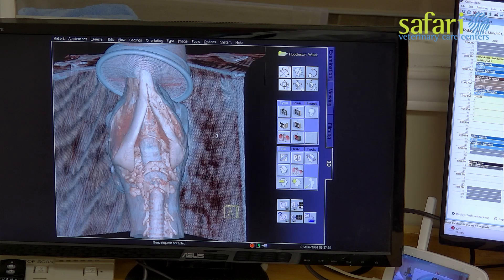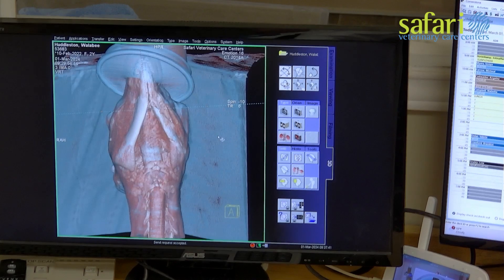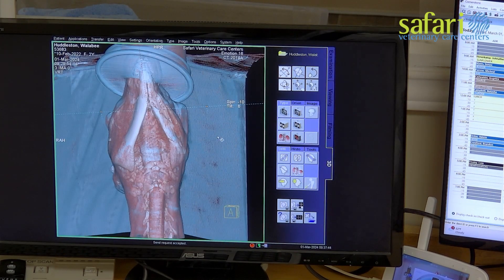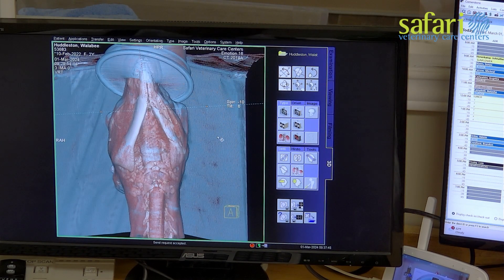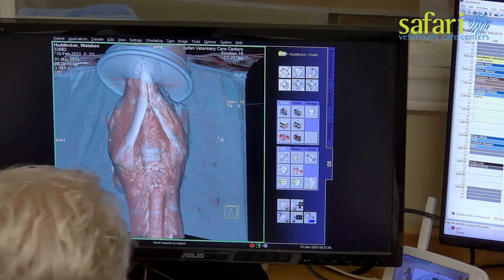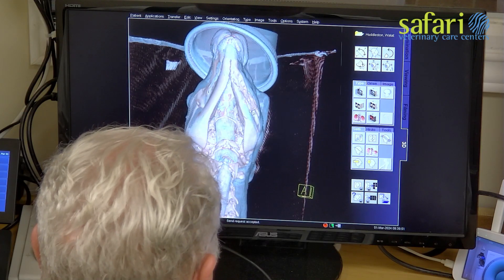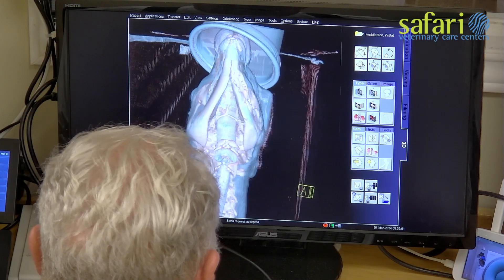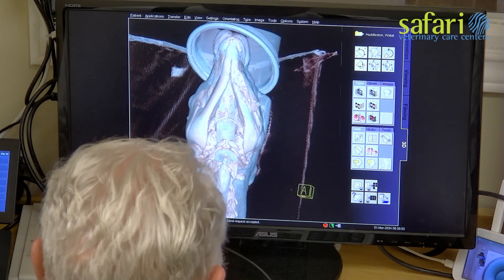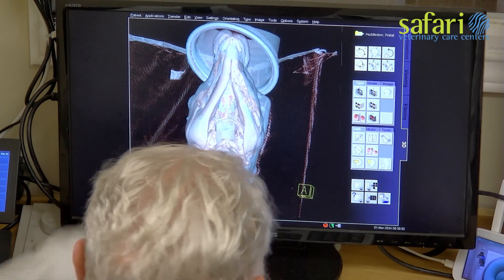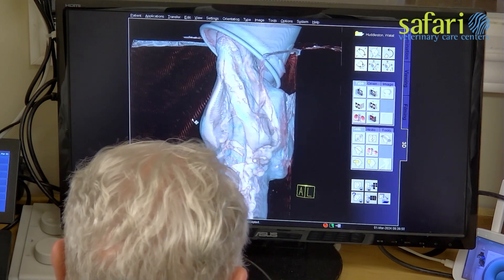Notably, on the left jaw — visible on the right-hand side of the screen — there is a distinct bone structure resembling a D shape, surrounded by what appears to be pus in the jawbone.